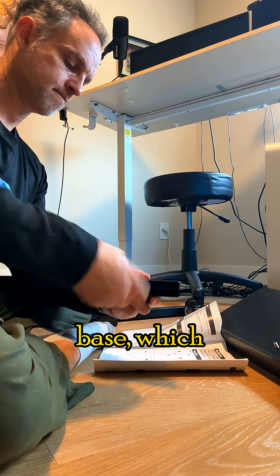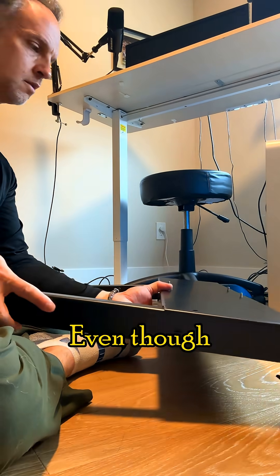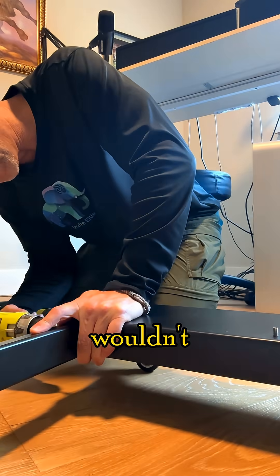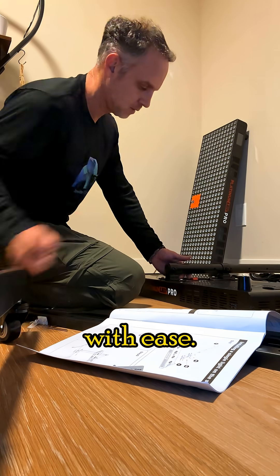I started assembling the base, which would ultimately hold my two-panel, full-body setup. Even though the panels were heavy, it wouldn't matter because the base is electronic, so I can raise and lower them on the stand with ease.